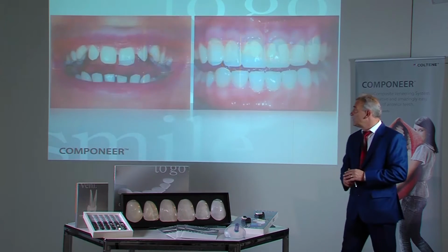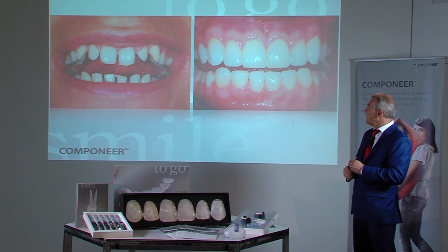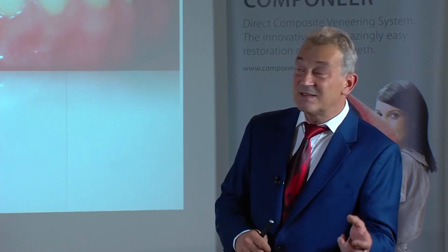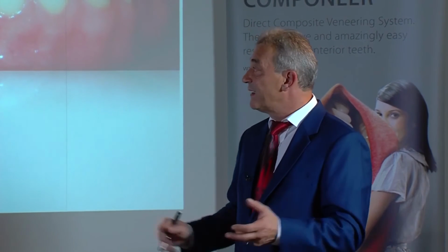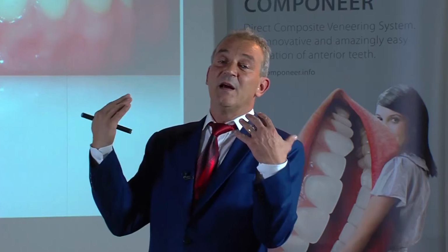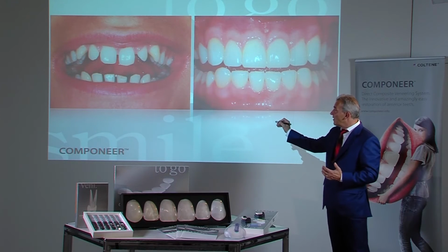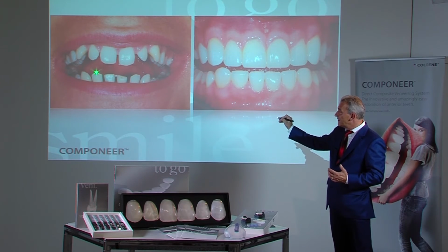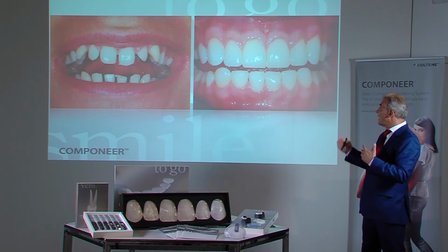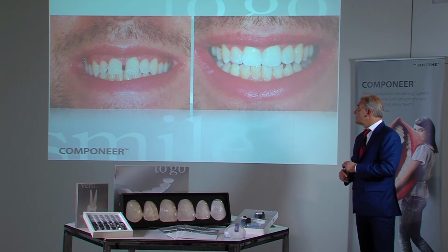The same applies to the mandible, and the gaps were also closed. One can see that the teeth in the maxilla have become slightly longer. This allowed retaining the proportions in the mandible, where it's often not possible to become longer. In this case, one can see a fanned-out mandibular front. Here, the mandibular anterior teeth have tried to be in contact with maxillary anterior teeth. One can also see the small abrasion corners on the mandibular anterior teeth. These cannot be elongated. For this reason, the mandibular anterior teeth would appear too wide in proportion when closing the gap.